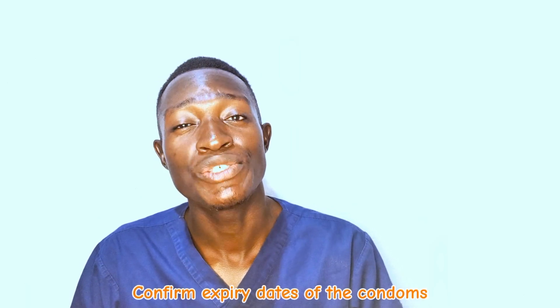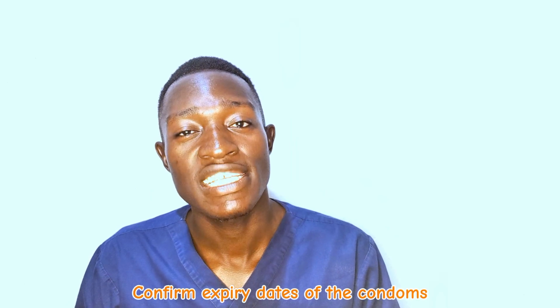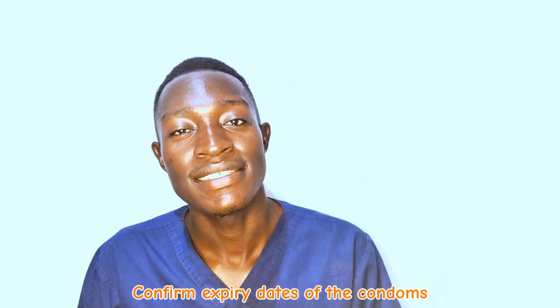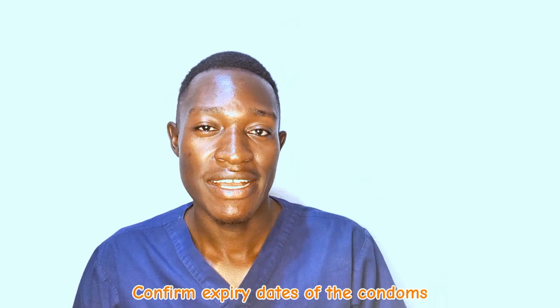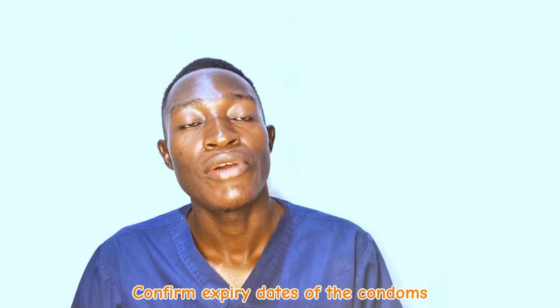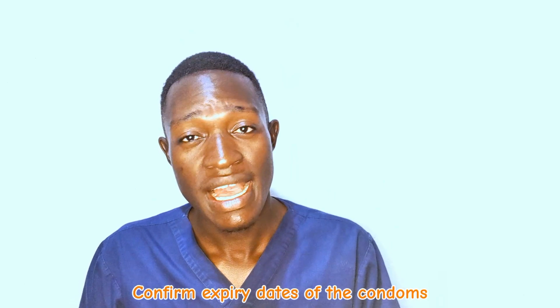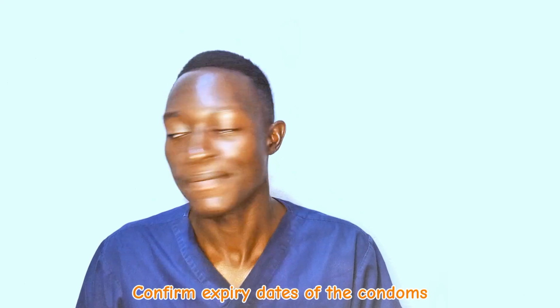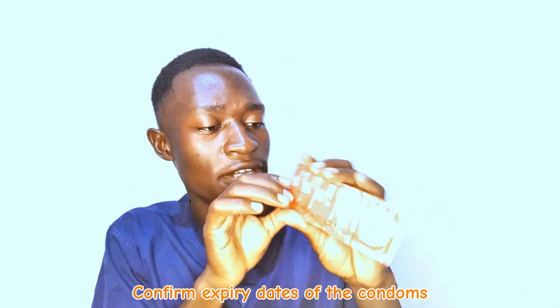The first step of using a condom is checking the expiry dates of the condoms. Ensure you check if the condoms have expired. Using expired condoms will result in you contracting infections and also getting pregnant, because the effectiveness of the condoms only lasts within the days before they expire. So first of all, we look for the expiry date of the condoms.